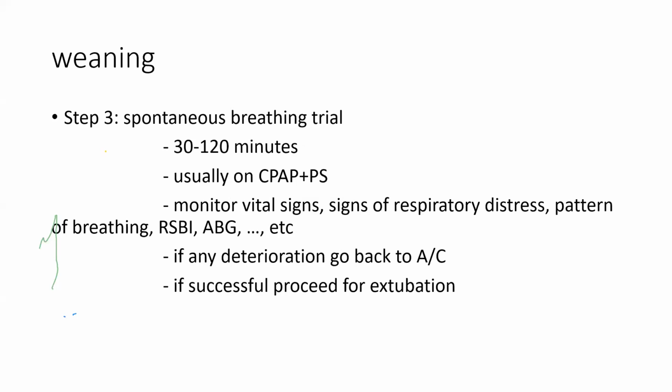Step 3 is what we call the spontaneous breathing trial. You allow the patient to start breathing on his own spontaneously and watch him. If he does well during this trial, which typically should take between half an hour and 2 hours, and I'll tell you in a minute what "does well" means, then you can extubate the patient and allow him to really breathe spontaneously. As we said, the most popular mode of spontaneous breathing trials is pressure support. We usually couple it with a constant PEEP, so we call it CPAP plus pressure support.